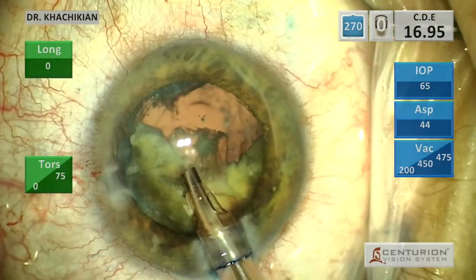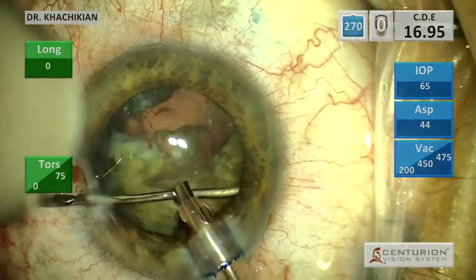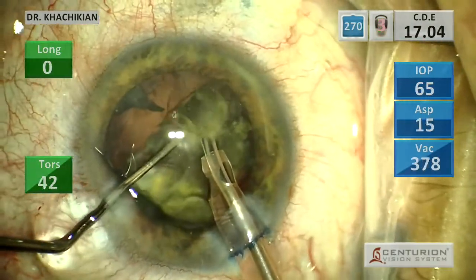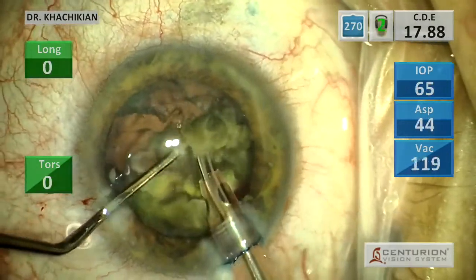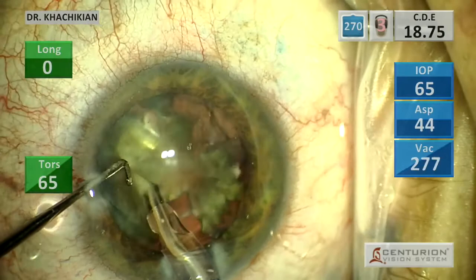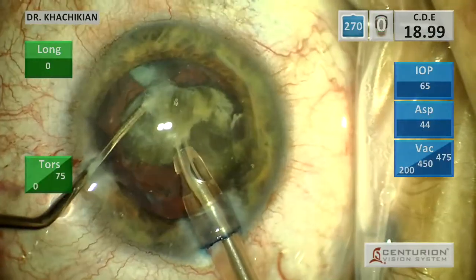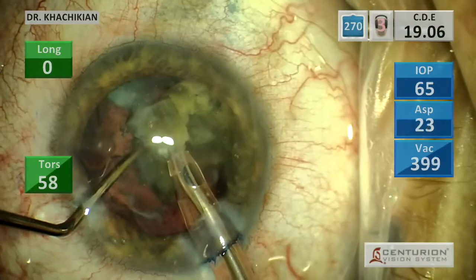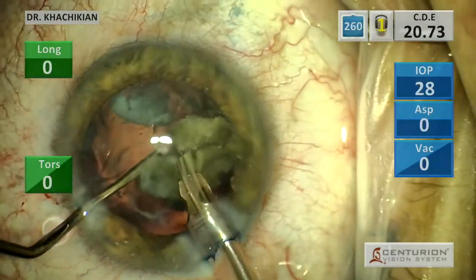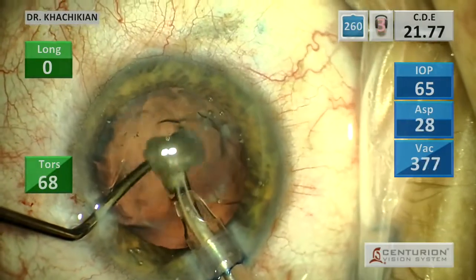Sometimes I'll also use the viscoelastic diagnostically — is there a rupture to the posterior capsule? Can I stick the visco back there? Is it filling the bag or going posteriorly? In a case like this, that is very important. When I use a lot of viscoelastic with a really dense lens, I give the patients a Diamox in the post-operative area to ward off any pressure spikes from viscoelastic blocking the trabecular meshwork or Schlemm's canal. All the IA in the world doesn't get that viscoelastic out, so that's where Diamox is helpful.